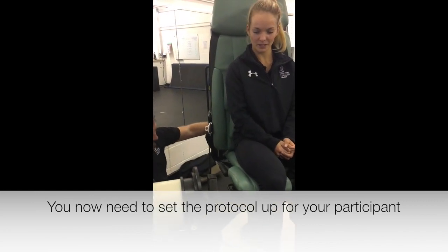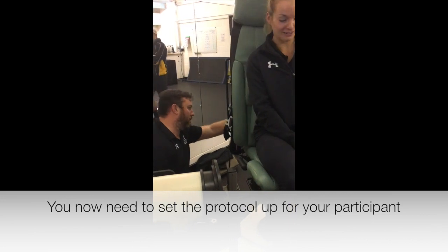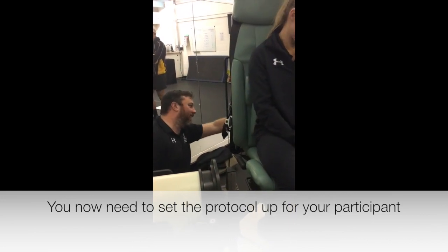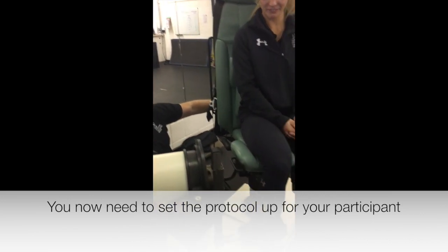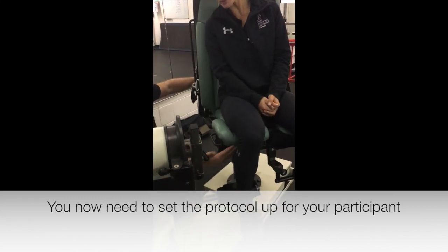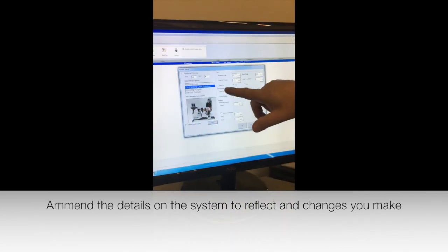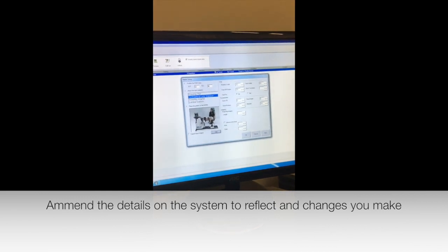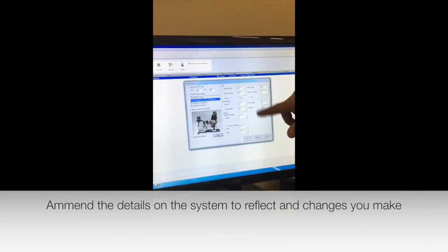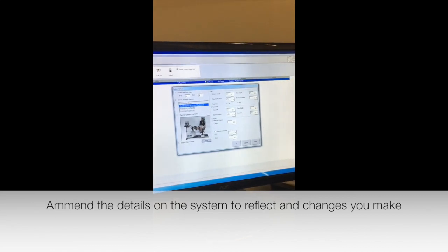Is that moving you forward? Yeah, lower back. Right, so if you flex now, is that better? Yeah. The box is in the way, but yeah. So you're pretty clear behind the knee there, that's okay. So now I've changed that to 20. All I would do is just type in back translation, not fore and aft, sorry. 20 in there, and the machine will remember it next time we got Steph on and we were testing.